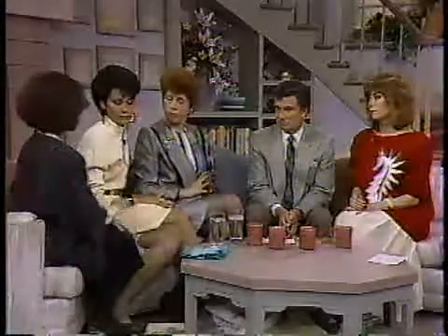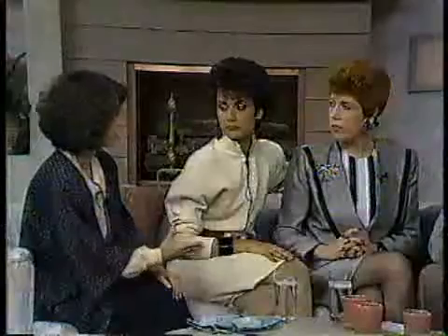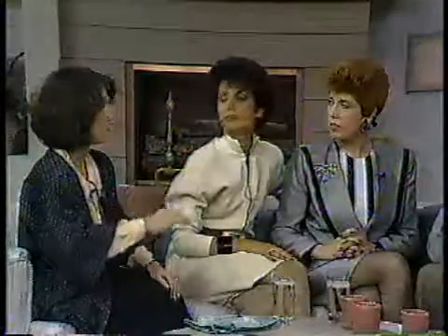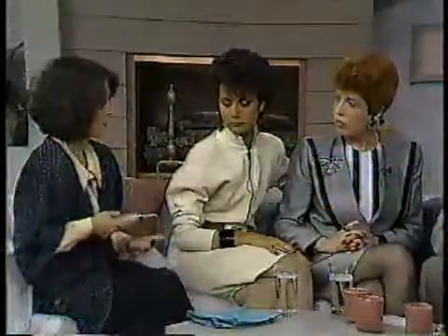Okay, let me just tell you, in Jill's case, with the implant that she's going to have, I go through the armpit, so there are no scars on the chest, because she doesn't need an uplift. She's perfectly fine. All she needs is volume. I go under the armpit, leaves no scars. It's a small incision, and I put in an empty bag, which I fill in while it's already in. So the incision is very, very small.